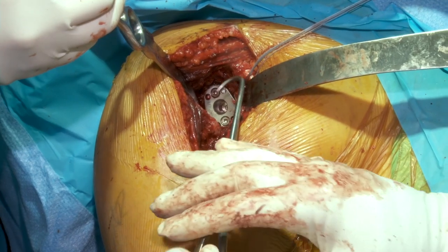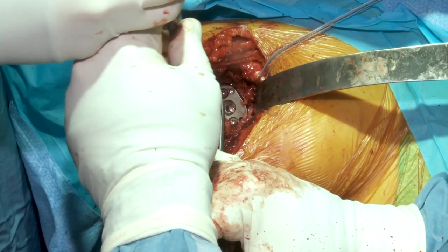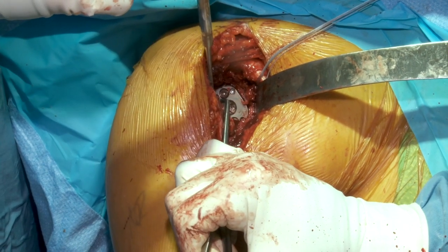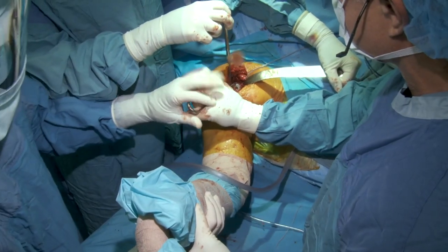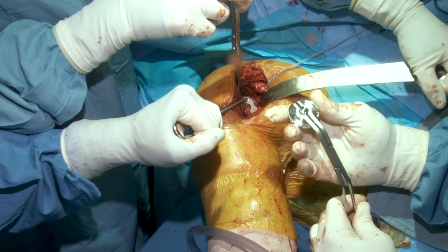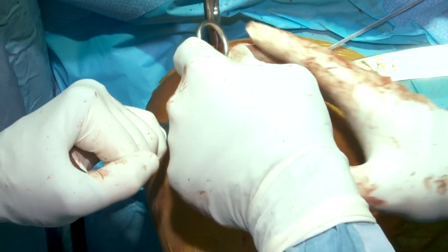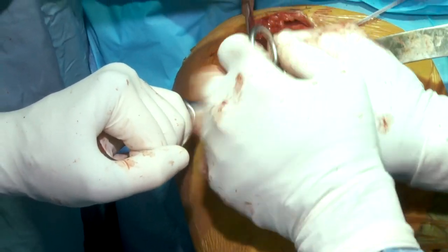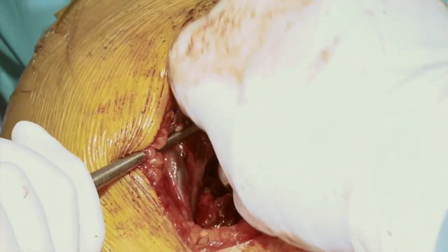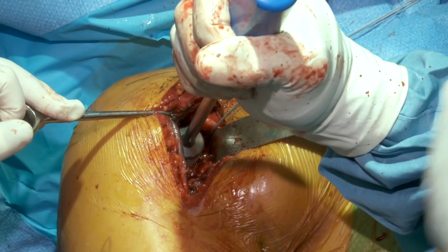What I prefer to do is place a bone hook through the center of our actual humeral head cut. We'll relax on our posterior retractor, have our assistant lift up the arm and pull on the bone hook — which keeps it off the face of the glenoid — and then slide the glenosphere in. We want to make sure it's away from the two ridges, and we'll slide this down and drop it right into our actual glenoid baseplate. Then we'll impact it into its final resting position.